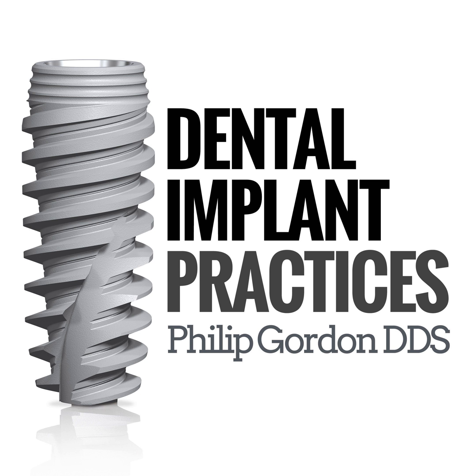And then I got involved with another root form implant from a gentleman, Tom Driscoll, which the implant was called Titanodont, and it was manufactured by a company called Miter, and they were owned by a German company, Boehringer Mannheim, and it was a 2-piece finned implant. And I got an idea when I was working in Switzerland about an abutment that would go on with a locking taper.